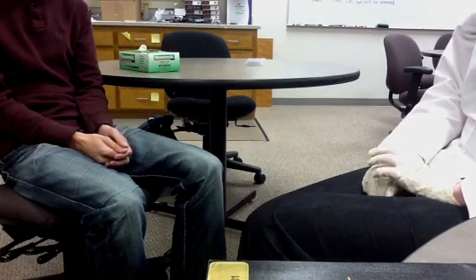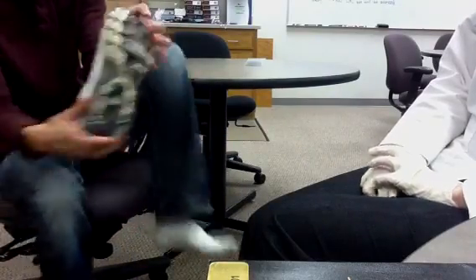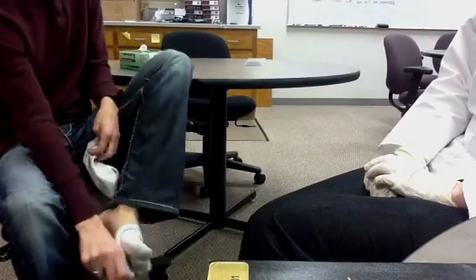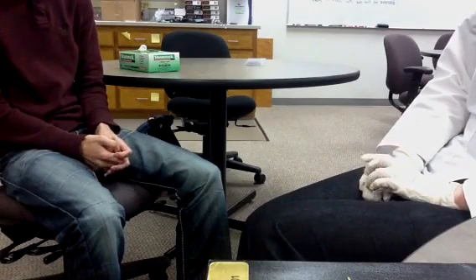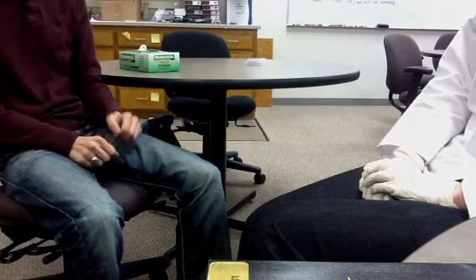Now begin your foot inspection. Please remove both your shoes and your socks. The purpose of this exam is to assess for and prevent any possible long-term complications that can result from uncontrolled diabetes. For instance, loss of feeling in your extremities, particularly your feet, is a major concern. Therefore, it's important that you have a monofilament test completed by a health care professional annually. You should also complete a daily self-check at home to avoid long-term complications. It may also be beneficial for you to have your feet examined at each doctor's visit.